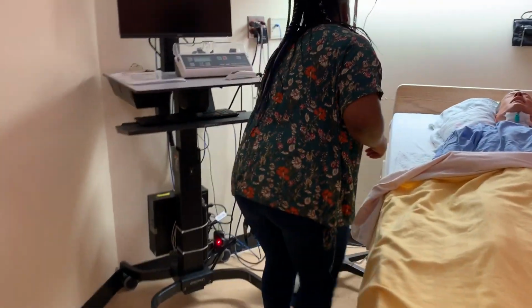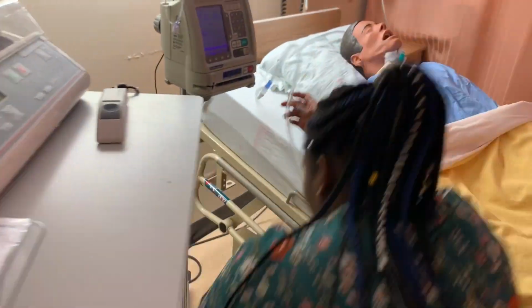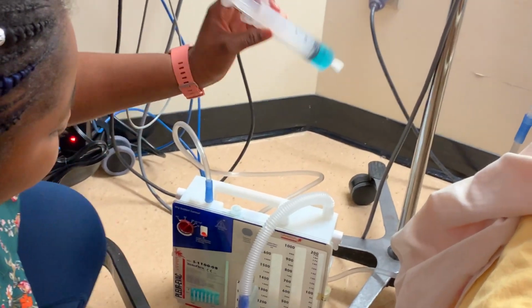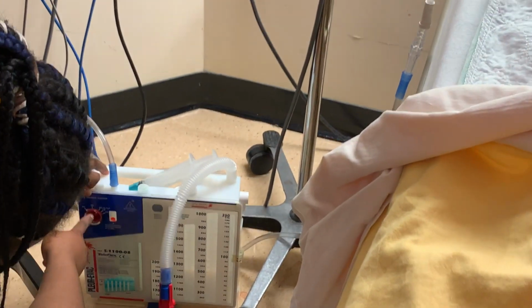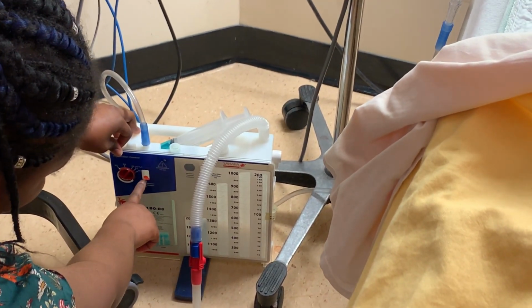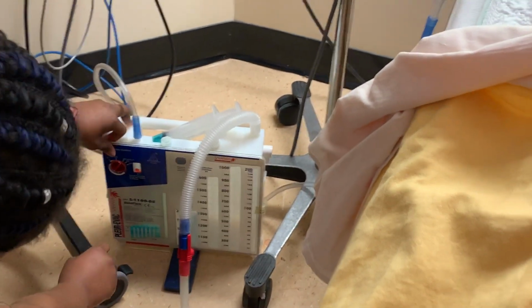I calculate that for the first 15 minutes, 12. Yeah, so coming down here, I have to make sure I have extra water just in case the water in this finishes. And I'm also going to check this to make sure it's in the, so the other is 20 centimeters water and this is 20 centimeters. I have my orange ball in the middle there, it is visible.